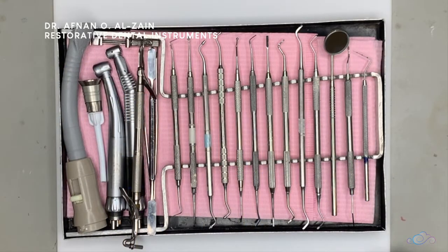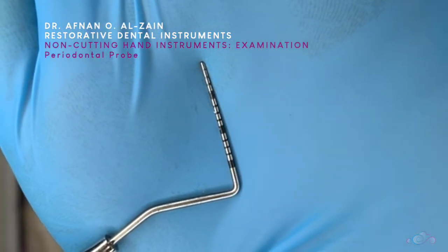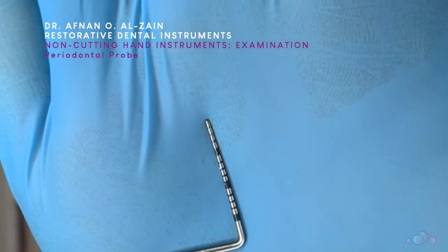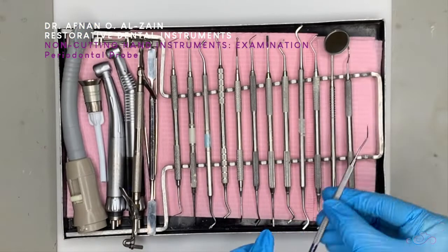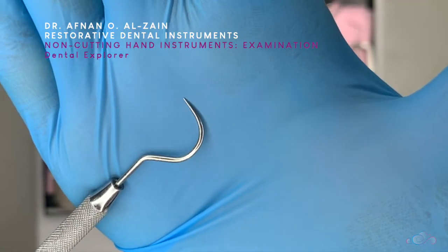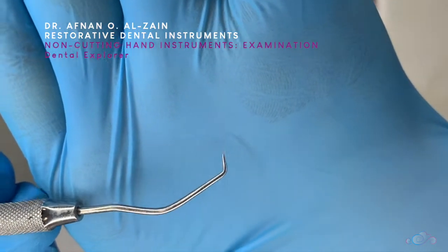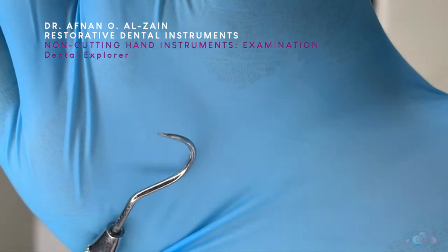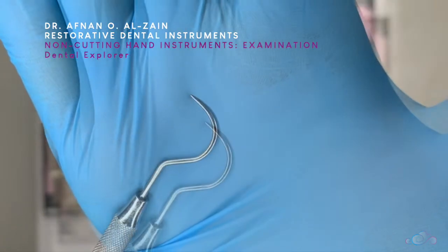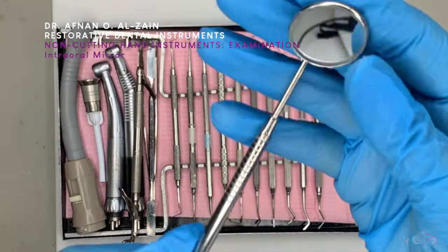We'll start with the periodontal probe. It's used to measure the periodontal pocket depth, or in the lab to measure the cavity depth. After that we have the dental explorer, which has two ends. It is used to check the smoothness of the cavity floor, to check clearance for class two cavities, and to check the restoration margins.